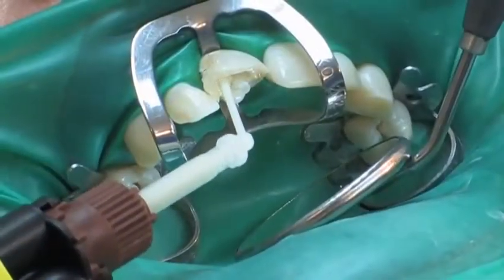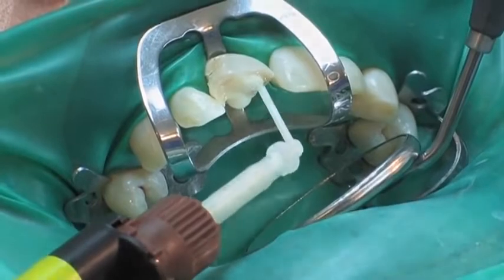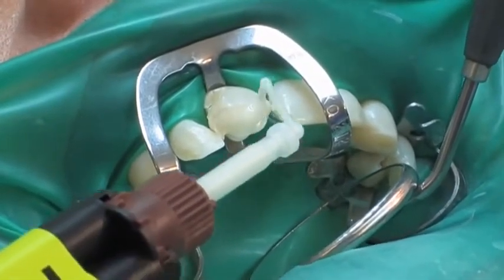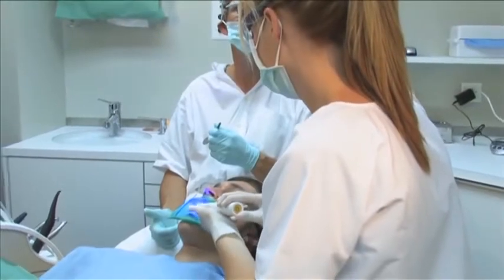Without any further delay the core build-up can be fabricated. The non-slumping consistency of Paracore allows for free-hand modeling of the core build-up and direct application onto the prepared tooth structure and retention head of the root canal post. The core build-up is light cured for 20 seconds per side.